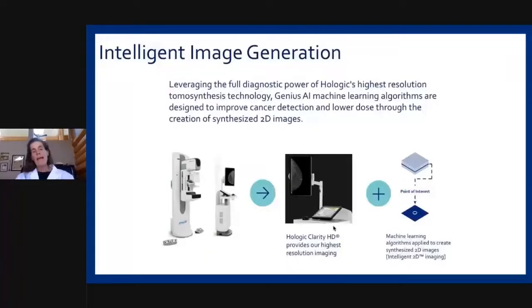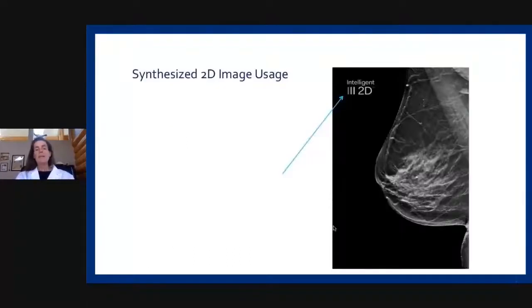And so now what we were able to see is with the synthetic view, there were some advancements from earlier images, which were called the first generation. Then we went to the second generation of the synthetic view and had increased resolution, which we're going to discuss now. So being able to quickly identify the synthetic view is really easy.